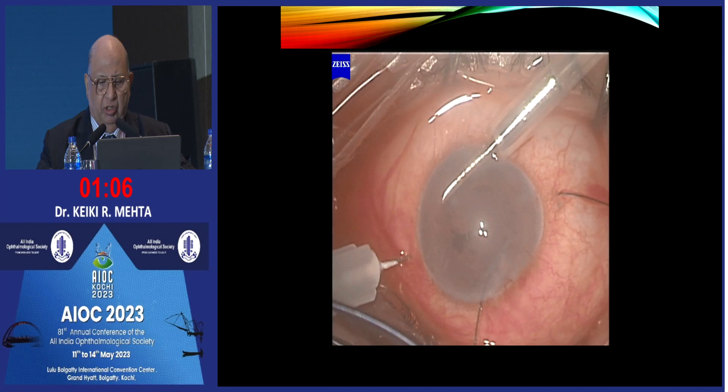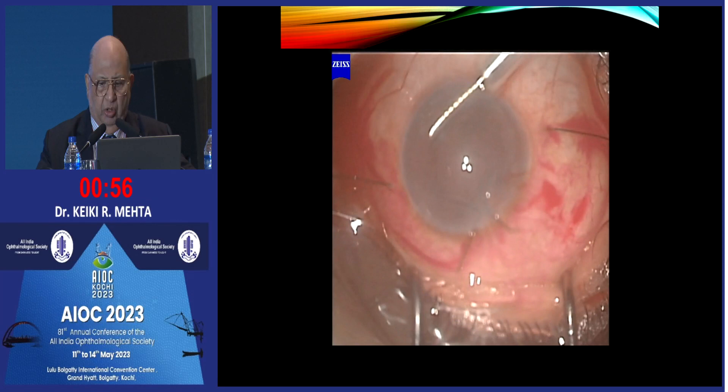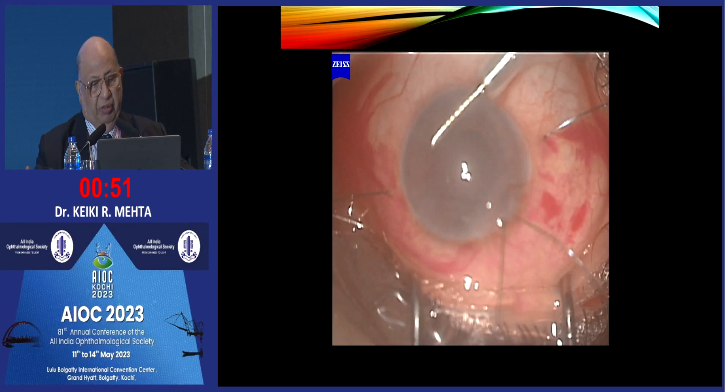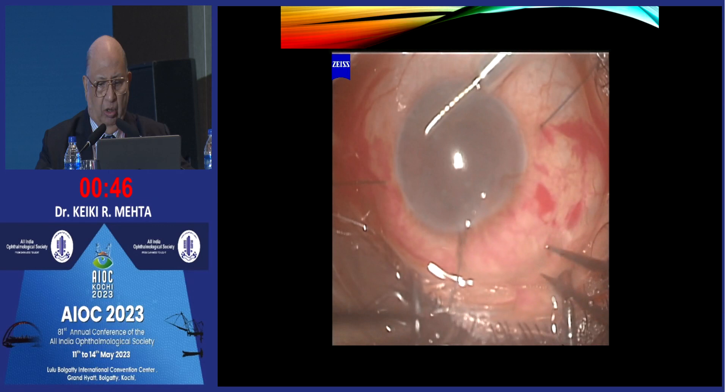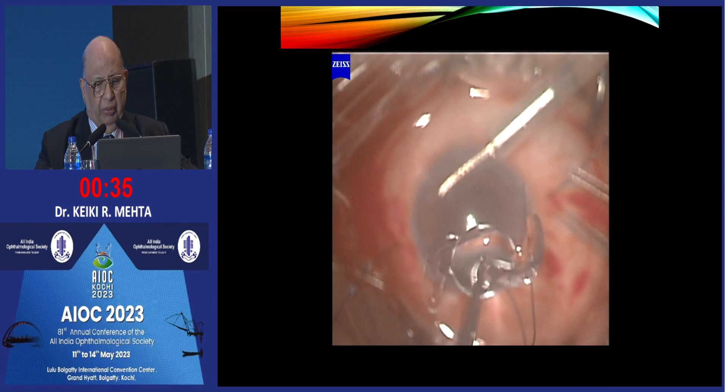No gymnastics — you don't have to enter the eye to do hand over hand, fist over fist. It is one of the simplest ways. Once you go in there again, hold the end of the suture and pull it out. So you have got two of these sutures into which you are now going to fixate two things: the lens and the dumbbell. You will now take the proline and make sure they are not crossed over — that is important.